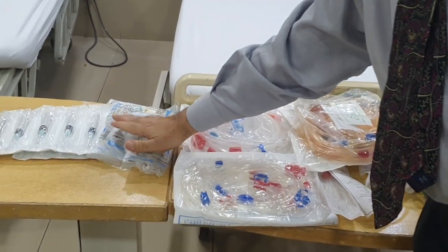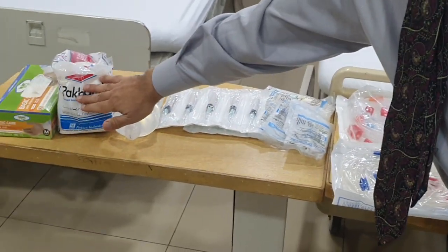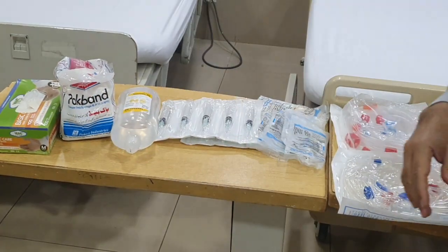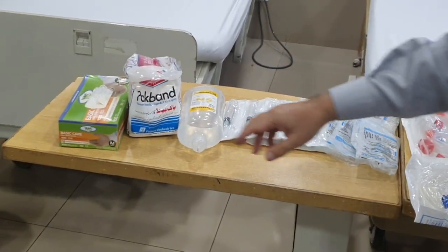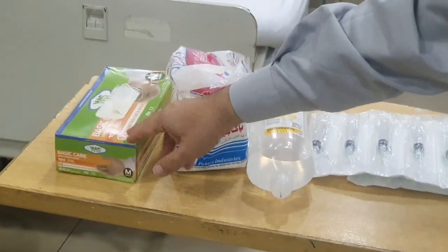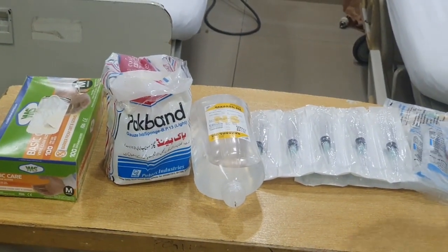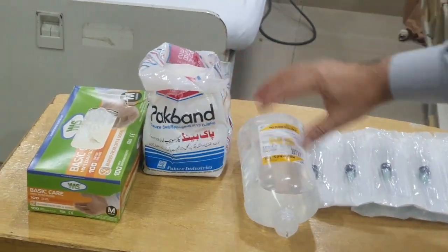We've got the IV drip sets, the needles, normal saline, a packet of gauze, and we've got gloves. Remember, the gloves are extremely important. They have to be used with every session, and you can use multiple gloves in order to prevent cross infection.